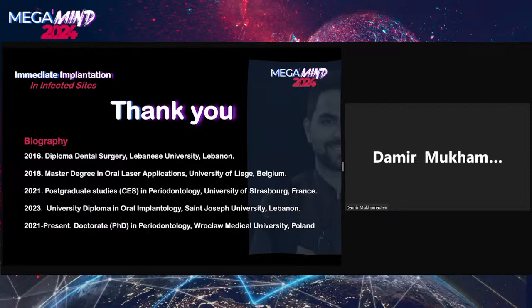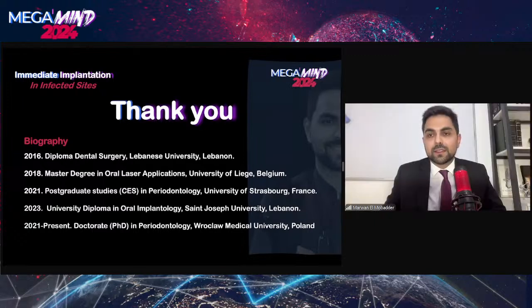Do you really believe that the photodynamic therapy and debridement had a real great influence on disinfection? I do believe 100% because I saw exactly this disinfection in the deep periodontal pockets, and deep periodontal pockets are not really different from sites with infection.